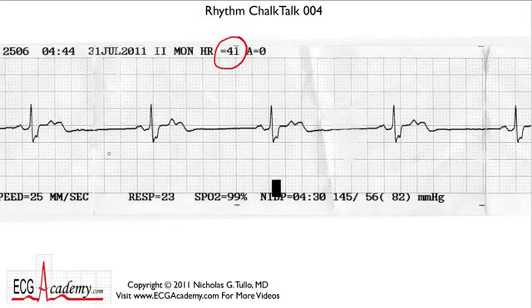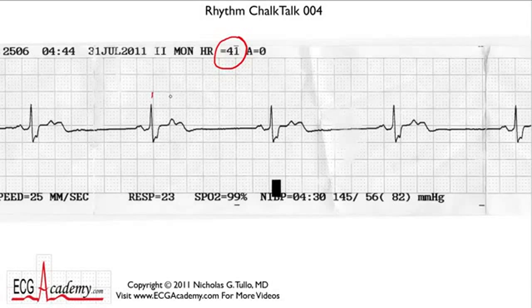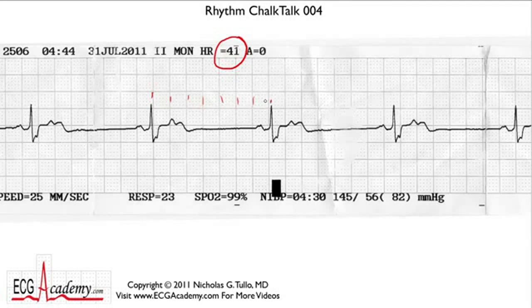You look at the tracing and the QRS complexes certainly seem to be regular. If you measure the rate starting at this heavy line and count off 300, 150, 100, 75, 60, 50 — it is about 40 beats per minute or so. That's pretty accurate.